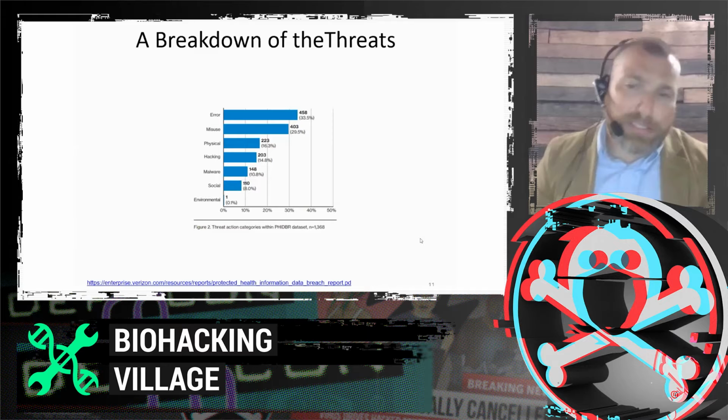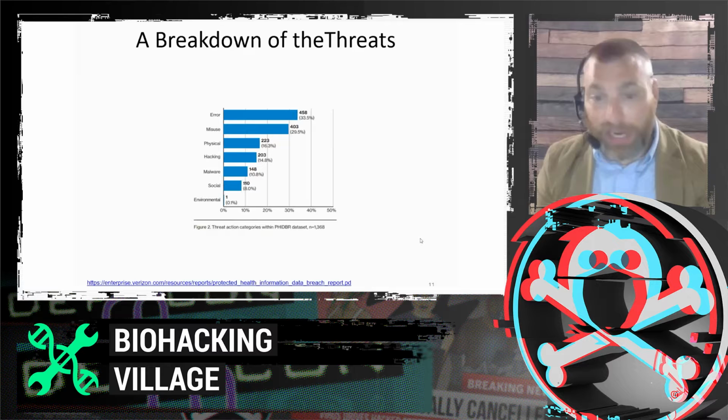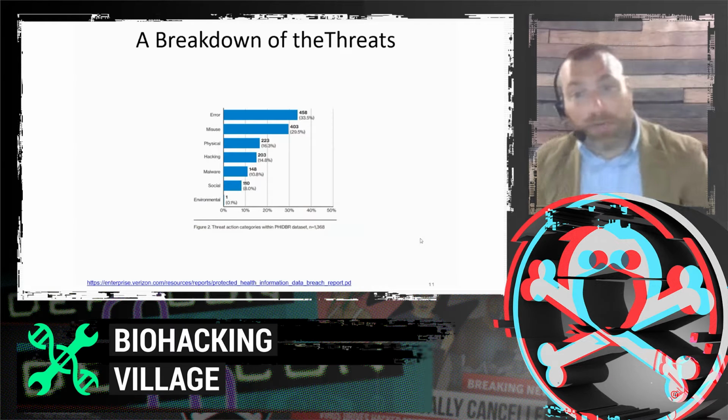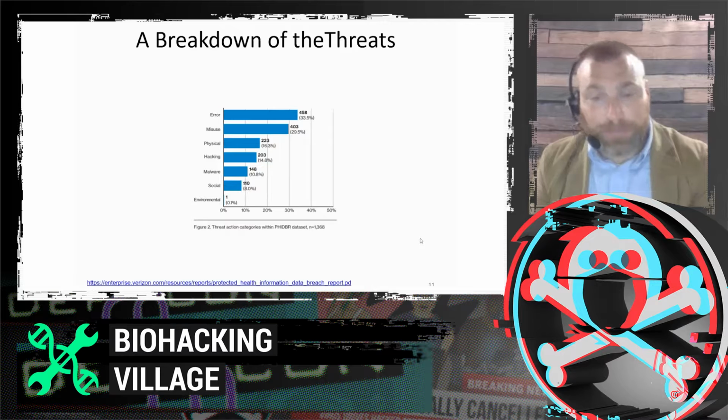So what's the breakdown of some of the threats? We talked, I said, some of this was non-malicious, so a lot of it is error. You can see over 30%, 33.5%, is just error. So, individual staff, maybe clinical staff working long hours, swing shifts, too many patients than they would normally have, certainly in the COVID era. Working with technology that they might not be familiar with, it's easy to make a mistake and cause a data breach that way.